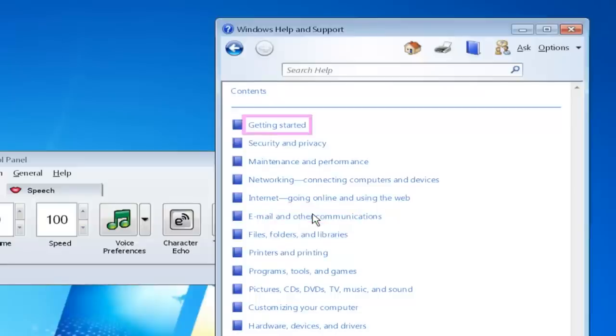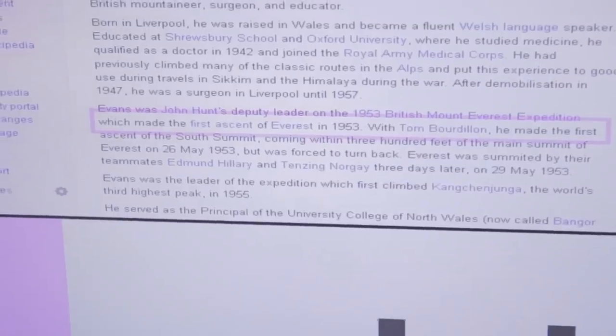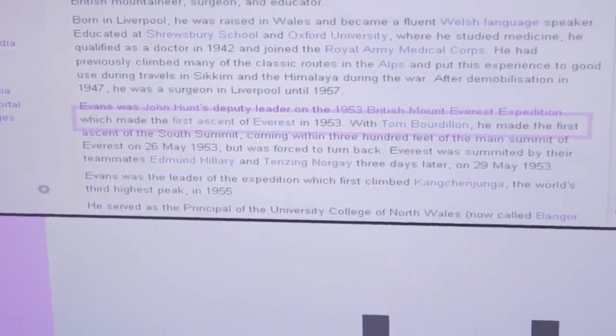Getting started. Security and Privacy. I tend to read at about 220 words per minute, which is faster than I used to read when I was sighted.